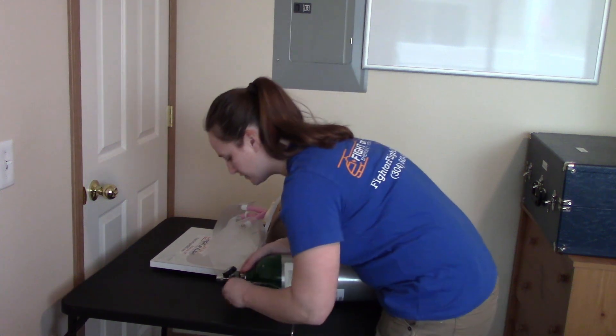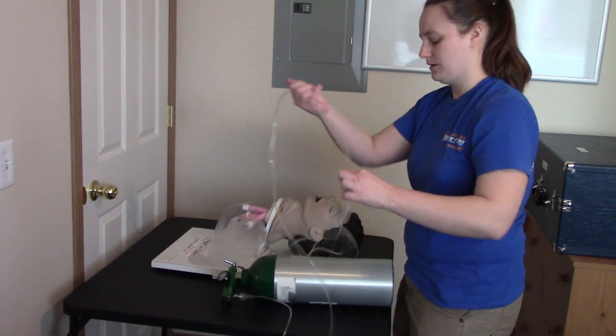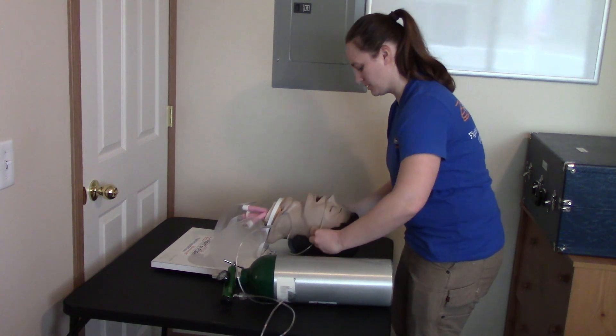I will adjust the flow to 6 liters per minute — no more than 6. I will put the nasal cannula onto the patient in the nostrils and around behind the ears.